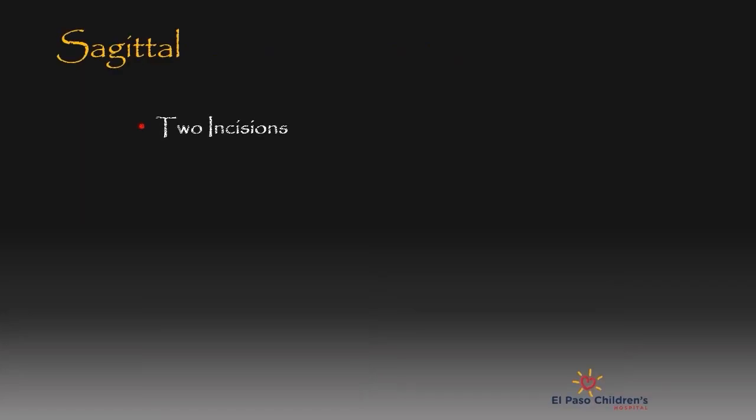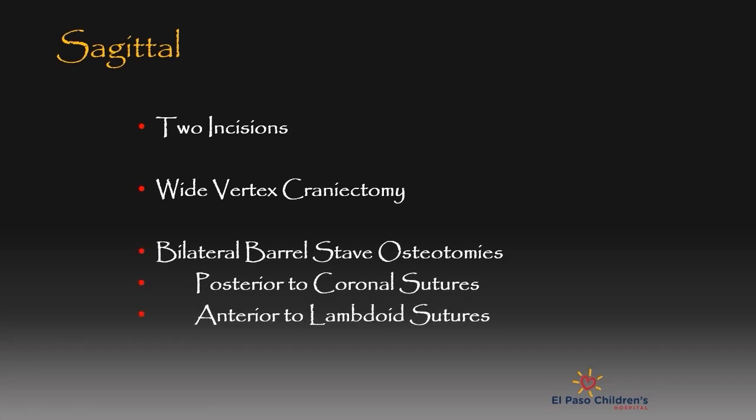We will now present the treatment of sagittal synostosis, which is more than a strip craniectomy, as we advocate the use of a wide vertex craniectomy with bilateral barrel stave osteotomies.